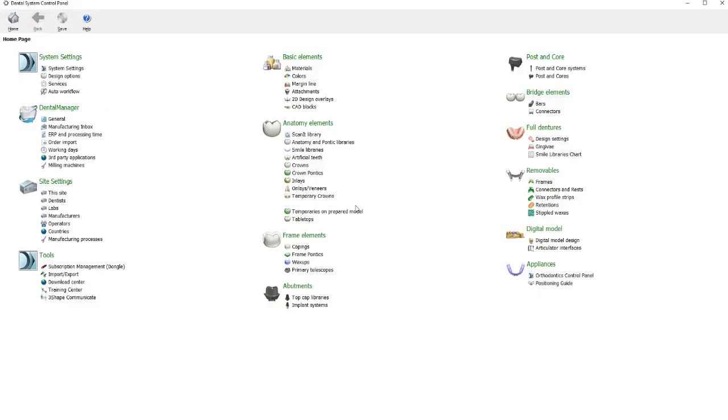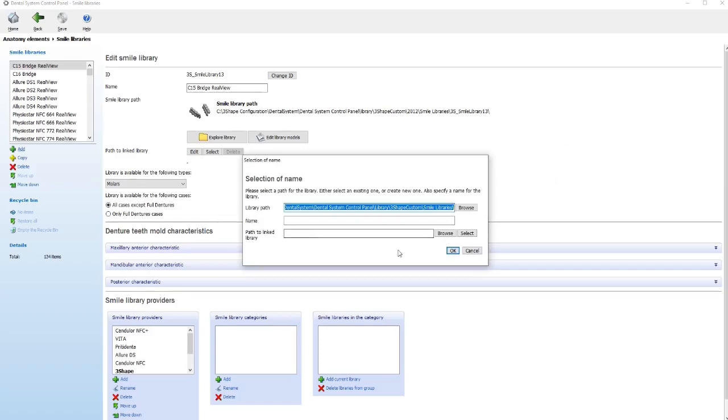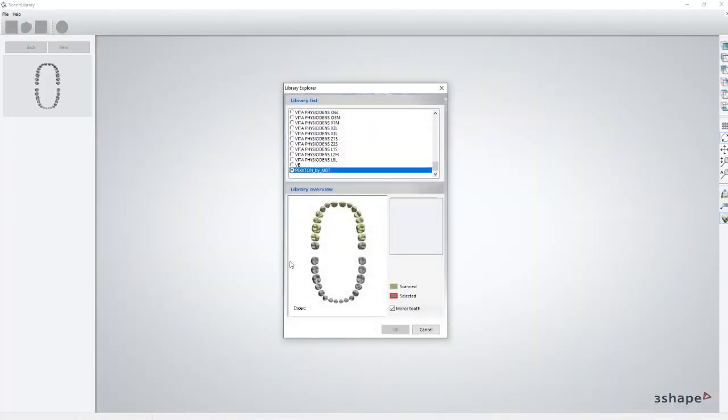In the control panel, go to smile libraries and I'm adding a new one. So click on add. In this case, I name it Pekkton by MDT. Click on edit library mode. And then it comes up. I'm going to click on this little tooth here to load the libraries. I have already loaded the upper teeth, so now I'm going to the lowers.